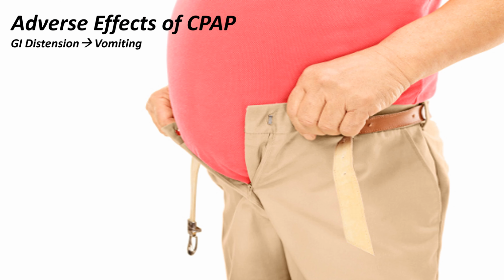GI distension, which can obviously lead to vomiting. We're going to want to keep a close eye on your patient's physical appearance because it would be preferable to catch GI distension before it turns into vomiting.